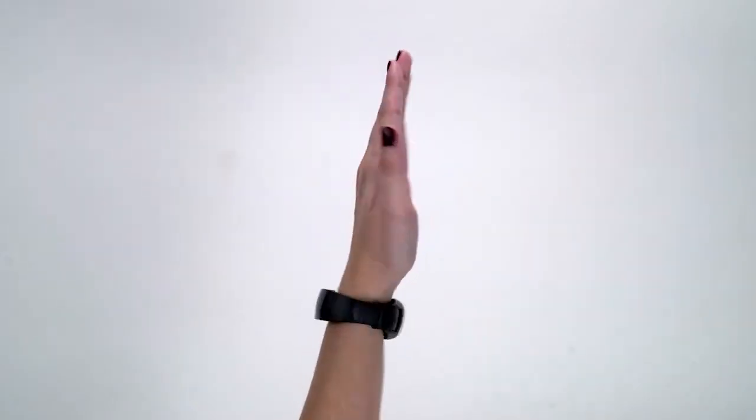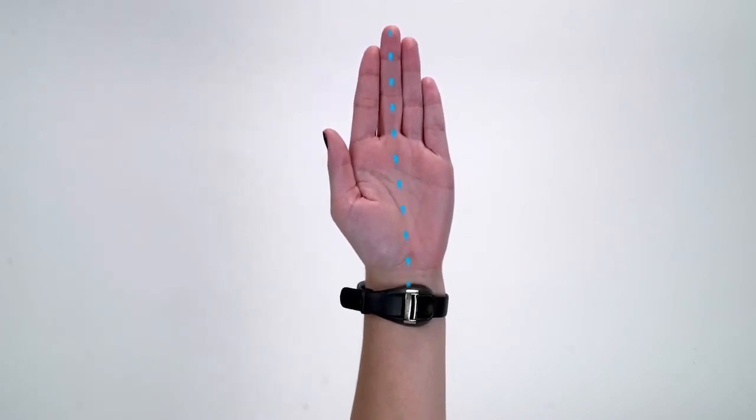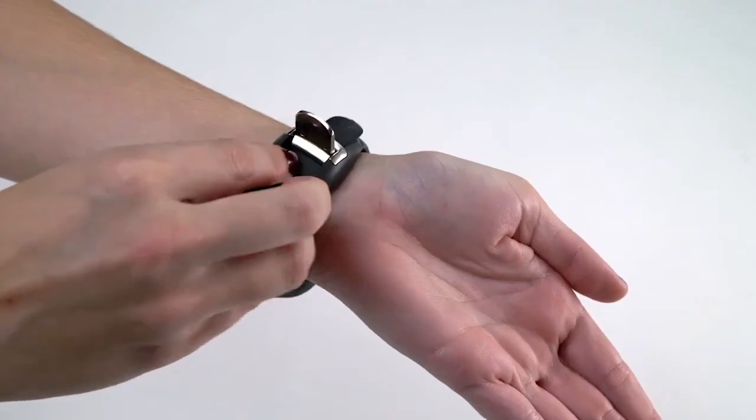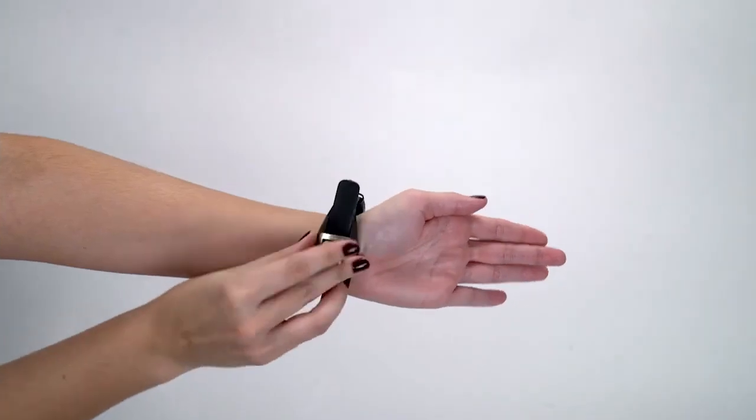You should feel a light tingling in your palm and or middle fingers. This signals that the device is positioned correctly. You may need to slightly adjust the position of the contact pads.